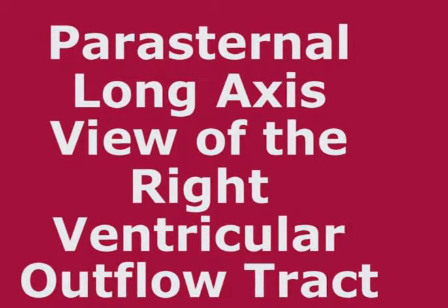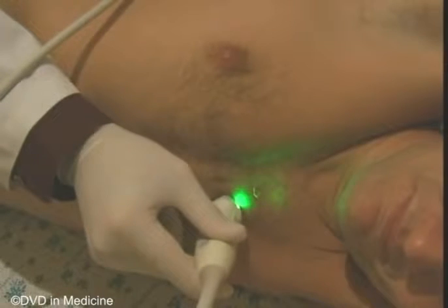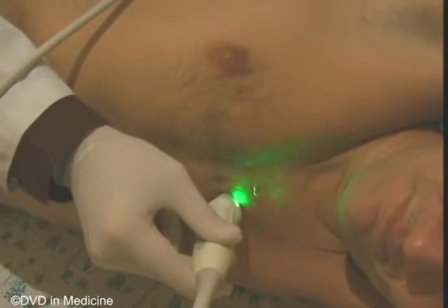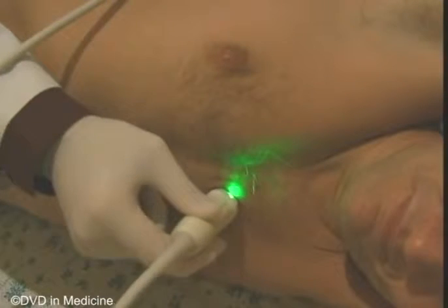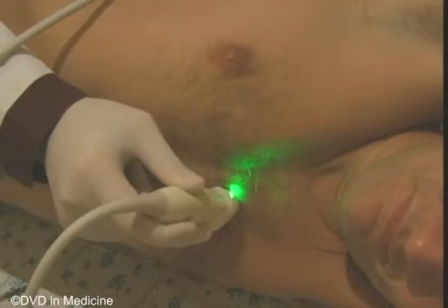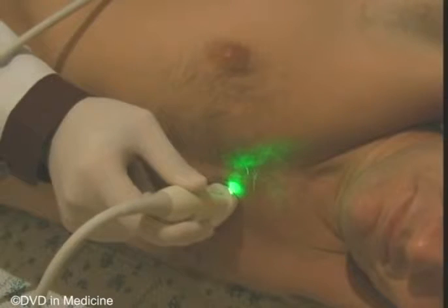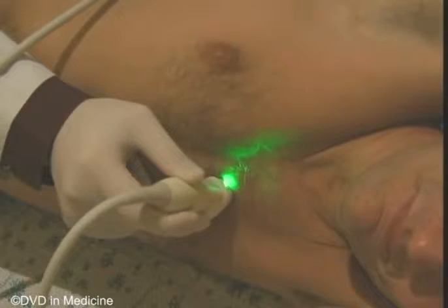Parasternal long axis view of the right ventricular outflow tract. Now one will try to see the pulmonary valve together with the right ventricular outflow tract and pulmonary artery trunk. After one has obtained a good image of the left ventricle from the parasternal long axis view, one must rotate the transducer a bit counterclockwise and angle it at a sharp angle between the transducer and anterior thoracic wall. It will appear as if one is trying to look under the left shoulder joint.